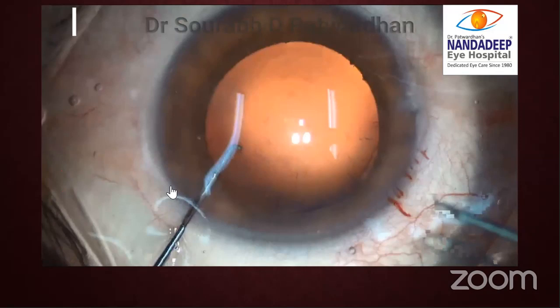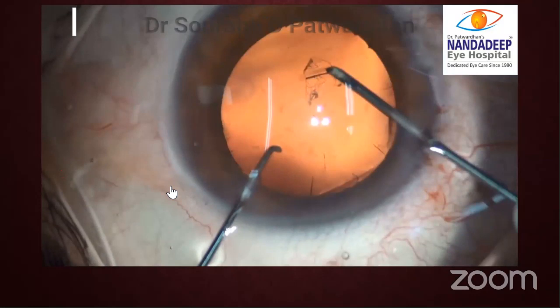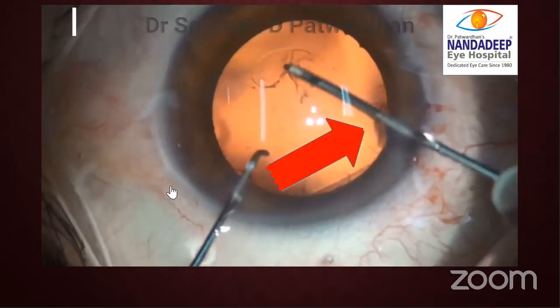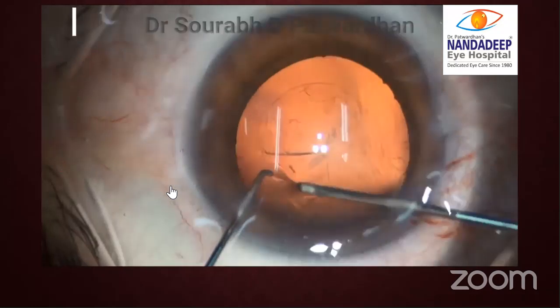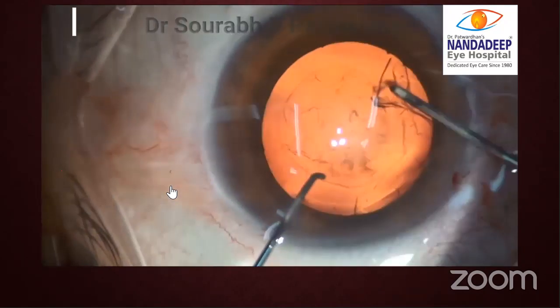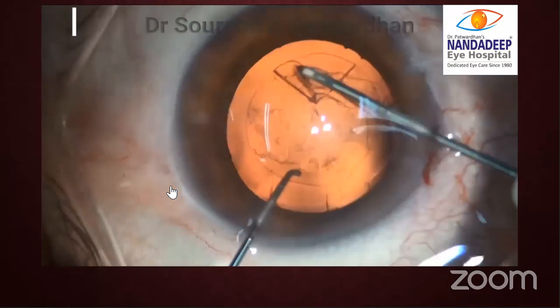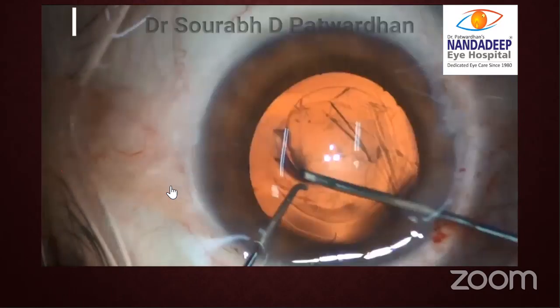So now watch here carefully how the cystitome is tenting up the anterior lip. You can see here the anterior lip is being tented, and because of that there is no visco leak. Even for the subincisional maneuvers also, you have to keep pulling up the anterior lip. And this is where the 3-bend cystitome helps, because it gives better ergonomic control over the anterior lip.